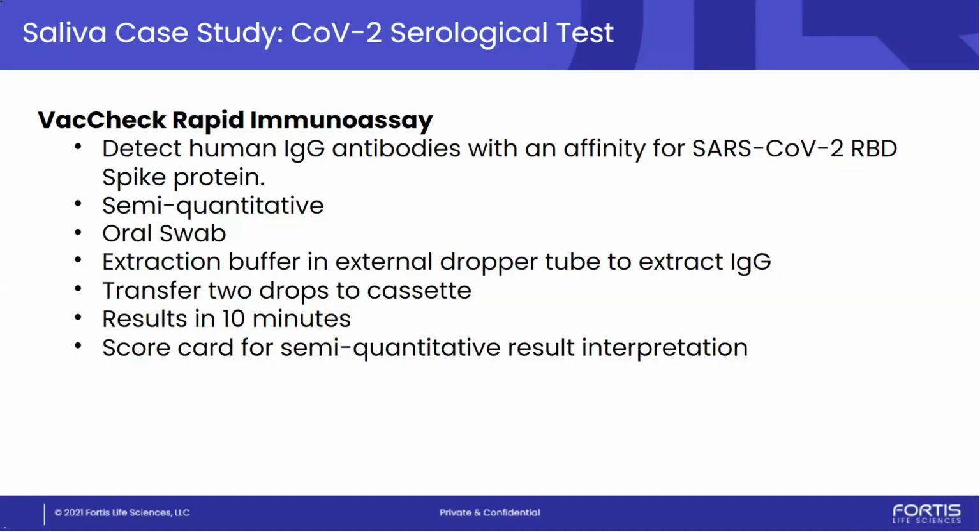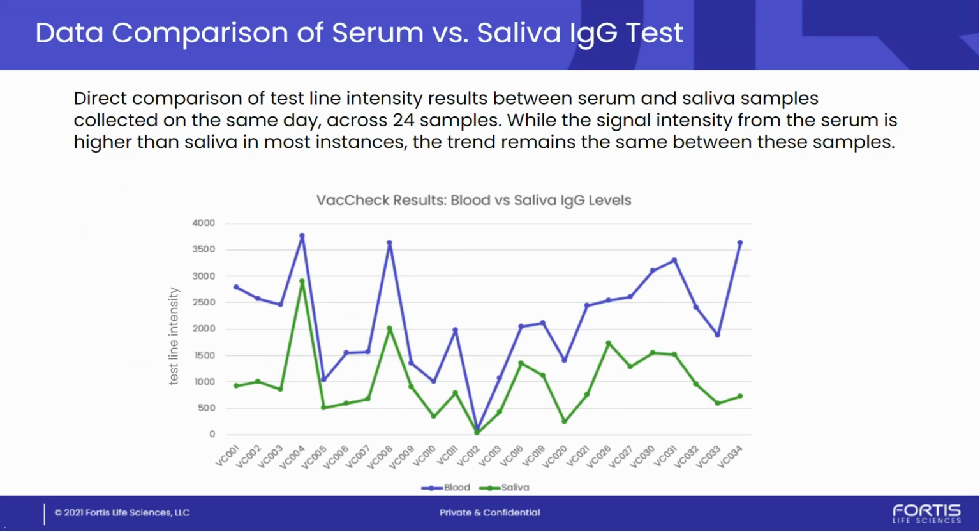But really, you can mirror side by side serum and saliva. I mean, that is what this graph here is showing, is that these are kind of right on top of each other in terms of correlation with one another. Now, again, though, you can see how much higher it is in serum versus saliva. So unless you have the right particles and develop the right systems looking at retention and collection, you've got to be careful. So that's another consideration. You can mirror blood, and specifically serum in this case, to saliva, but there's got to be a lot of considerations in mind when you're doing that development.